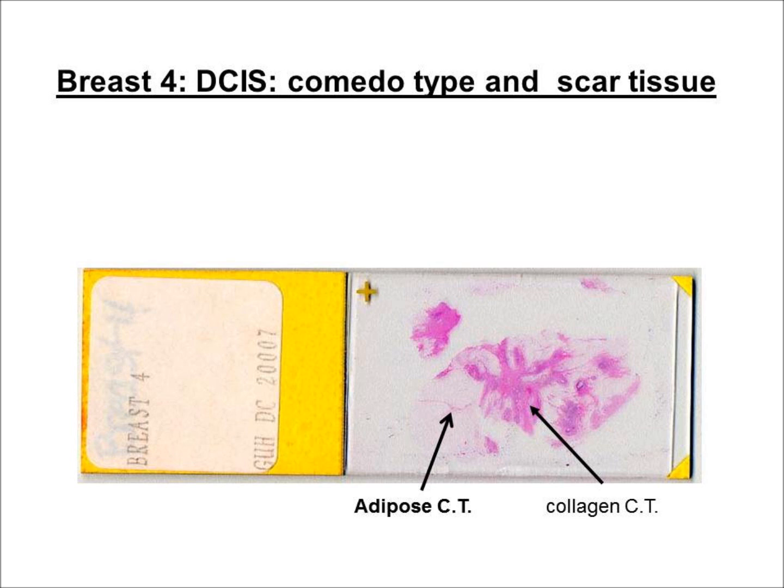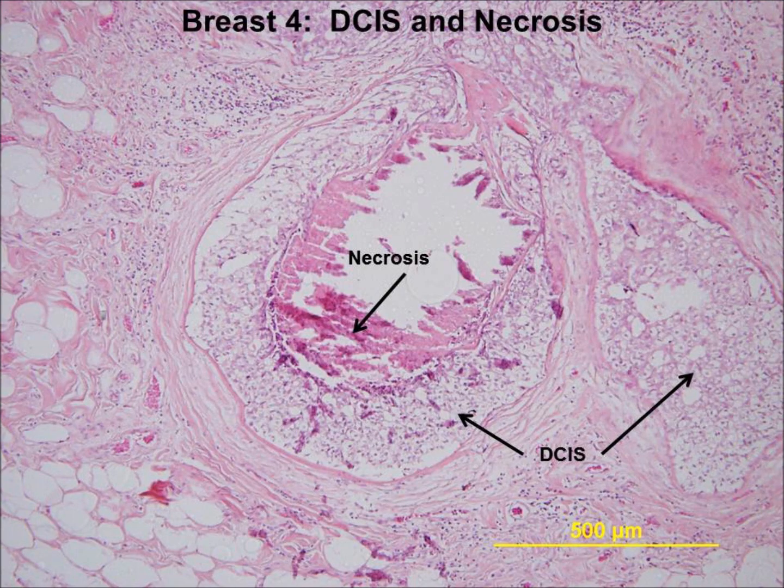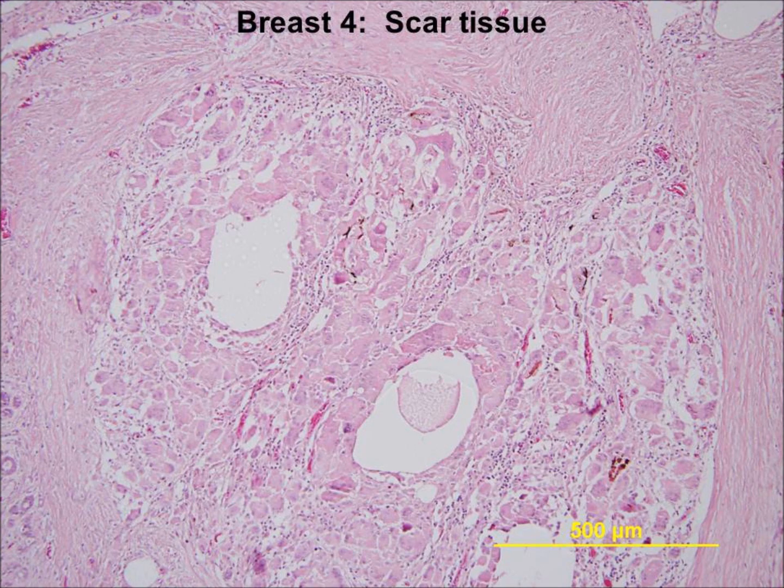By eye, examine breast slide number 4 and observe the presence of eosinophilic collagenous tissue that radiates out from a central region. This represents regions of wound healing. Under low power, locate the DCIS that is similar to that of the previous slides. Also locate a region of scar tissue that presumably resulted from a previous biopsy. It appears that in this patient, a biopsy had been taken, but the tumor tissue had not been completely removed and had to be re-excised.